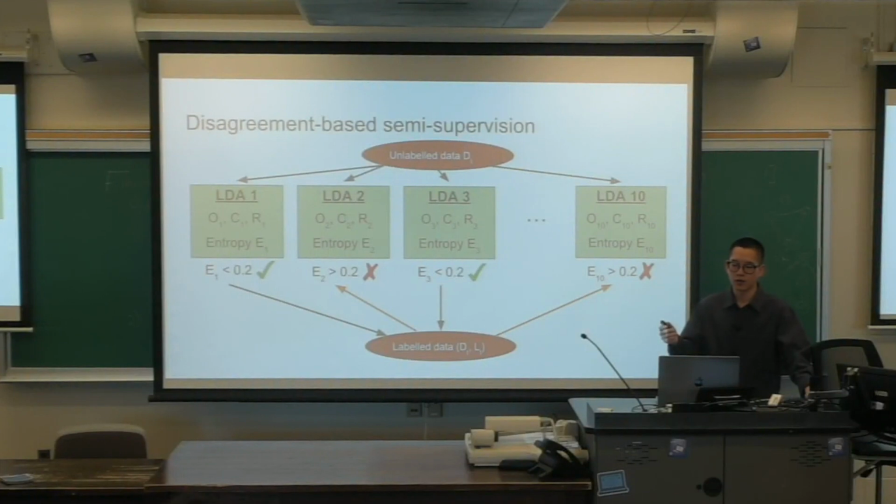Just to remind you, we now have more modalities than just EMG signals, and each classifier uses a randomly sampled subset of them. The intuition is that when we have multi-modality data and concept drift happens, some modalities may be robust to the drift while others are not. So we can use the classifiers with the robust modalities to help the classifiers with the less robust modalities. So that's the idea.